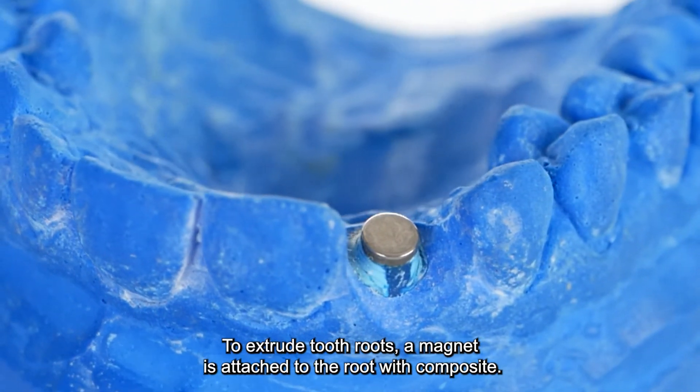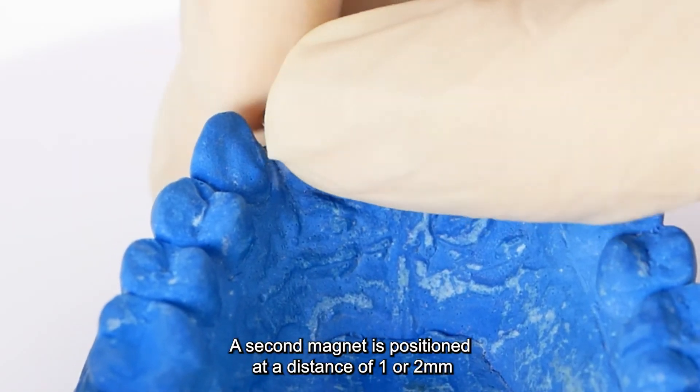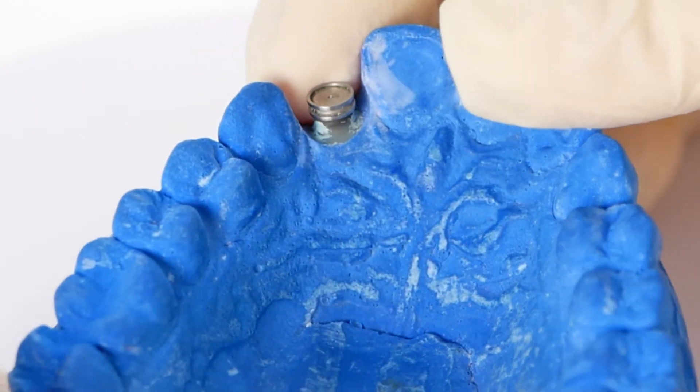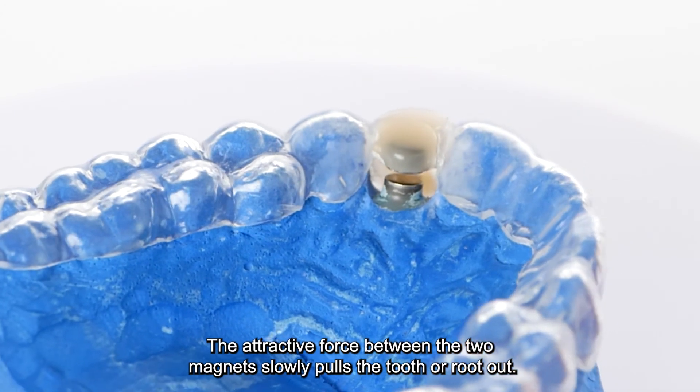To extrude tooth roots, a magnet is attached to the root with composite. A second magnet is positioned at a distance of 1 or 2 mm in a splint or even a temporary bridge. The attractive force between the two magnets slowly pulls the tooth or root out.